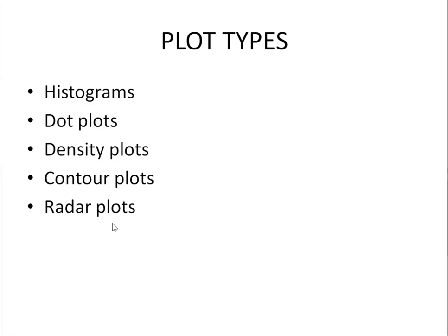What automated analyzer are you using in your laboratory? It's Beckman DXH 800. Excellent. So you are getting histograms in that. I use the same system. So you have seen histograms. Have you not seen a dot plot there? Dot plots are also there, sir.